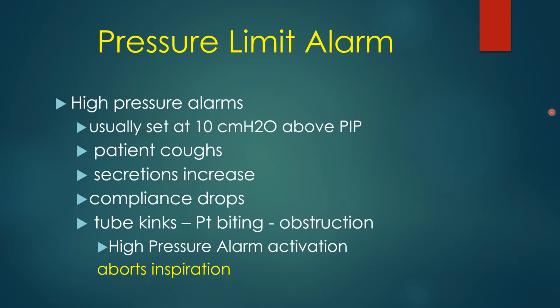So say, for instance, your patient is coughing a lot. Every time the ventilator starts to give him a breath, he coughs, and he may not be being ventilated. The high pressure limit could be reached at the end of inspiration. He got most of his tidal volume, or maybe he only got half of his tidal volume, or maybe almost none of his tidal volume. If it's pressure limiting, like with a kinked tube, it will pressure limit, pressure limit, pressure limit, and the patient is not being ventilated. So all ventilators have a high pressure limit alarm.